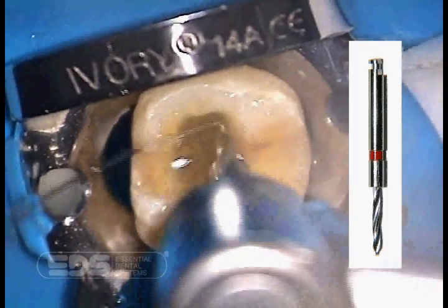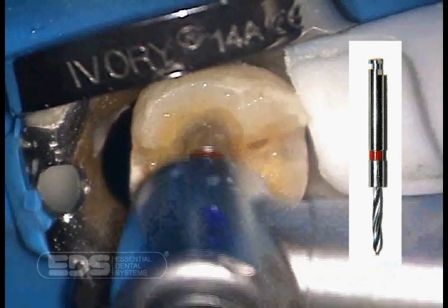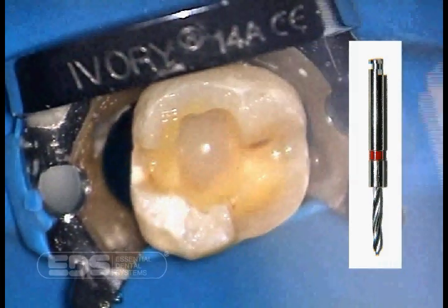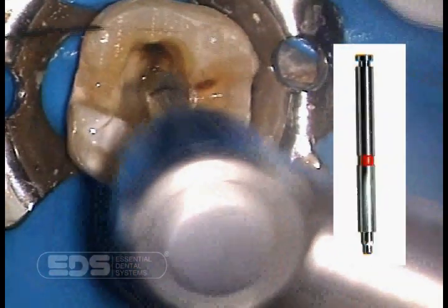Now we are using the red number 1 primary reamer to establish the full length of the post hole and the exact width to fit the number 1 Flexi Post. We then use the red number 1 secondary drill to make the box for the second tier preparation.